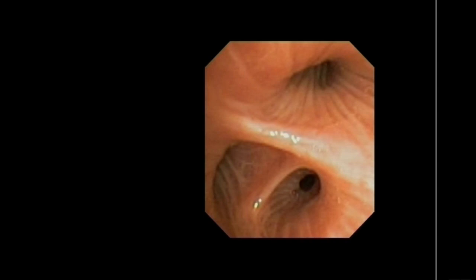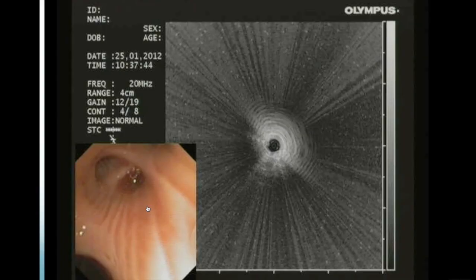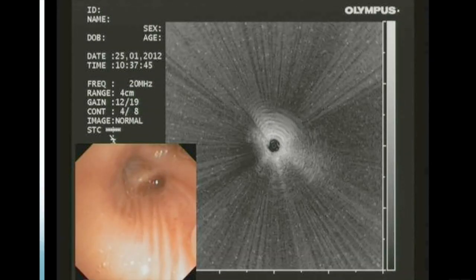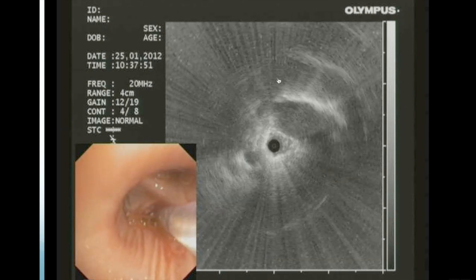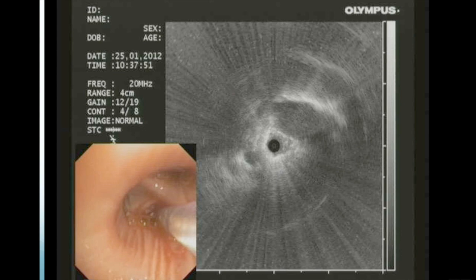Back to our case study — this is the endobronchial appearance of the right upper lobe. Here's the apical segment, the posterior segment, and the anterior segment. From the CT scan, you could see that the posterior segment is probably the segment that will contain the lesion. Here we've got the endobronchial appearance, and this is the radial EBUS probe being put out into the lung parenchyma. We'll see a change in the ultrasound image depending on whether the ultrasound is within the air of the lung or within the solid tumour. You'll see the spinning radial EBUS probe going into the posterior segment. There's probably a bit of a blood vessel here and mostly air artefact from being within the normal air of the lung.